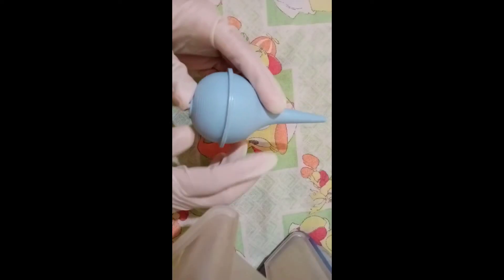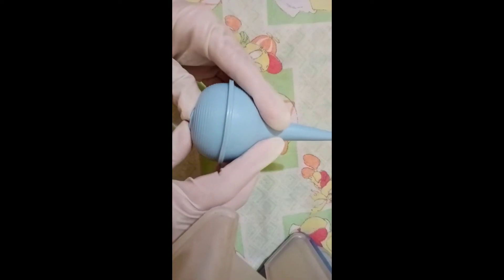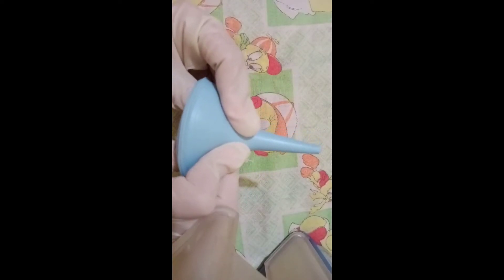As soon as the infant's head is born, suction the mucus from the mouth. We're now going to use the bulb syringe. Compress the bulb before insertion to prevent injury to the newborn's oral mucosa.